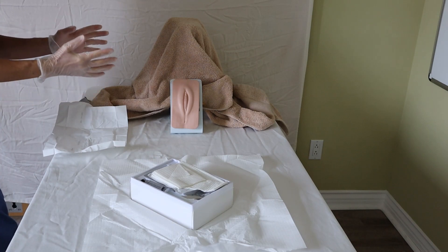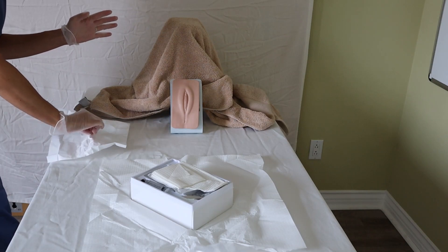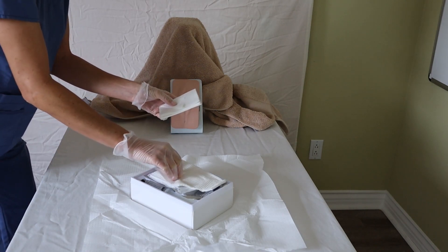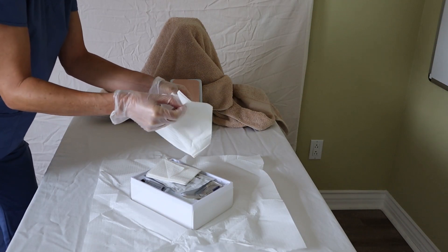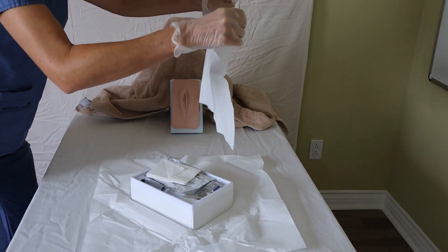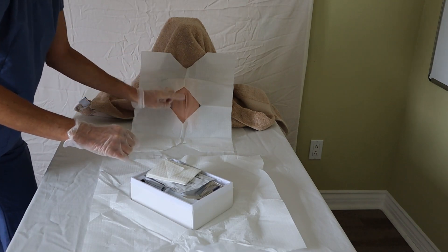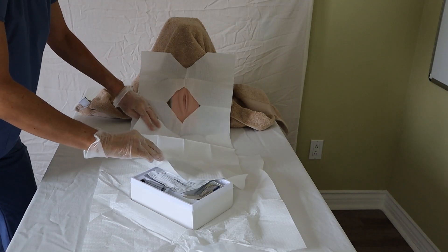Now that my hands are sterile, I can grab this wrapper — making sure the outside doesn't touch me — and get rid of it. Every catheterization kit comes with two drapes: one that is just a waterproof pad and the other is called a fenestrated drape, which has a hole in the middle. The shiny side always goes down as it is the waterproof side. Remember that your gloves are sterile so you don't want to touch anything on the patient right now. I use the other towel to extend my sterile field.